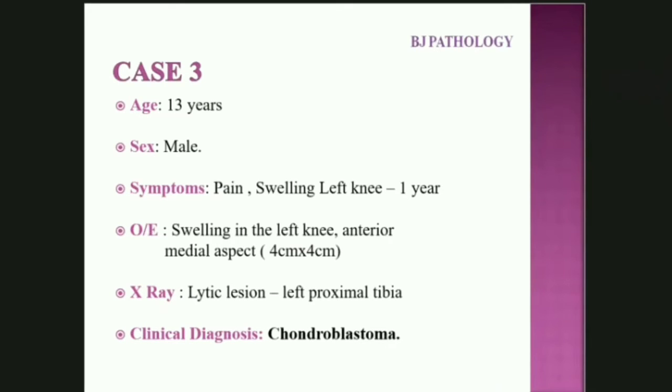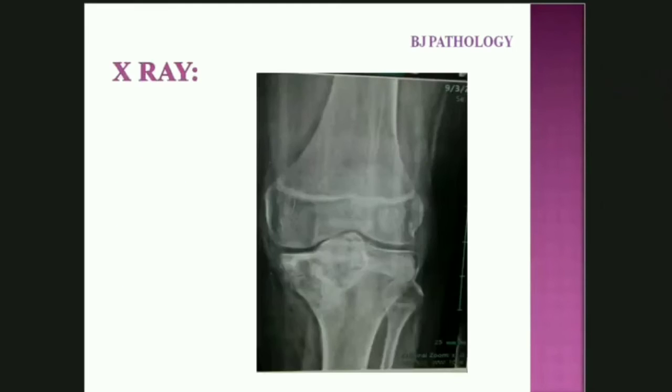So this was a case of a 13-year-old boy who presented with pain and swelling in the knee since 1 year, and X-ray basically showed a lytic lesion in the proximal tibia. So this is the X-ray wherein we can see this lesion with a sclerotic margin. It is present in the epiphyseal region. So that is an important finding, lytic lesion in the epiphysis of a long bone.